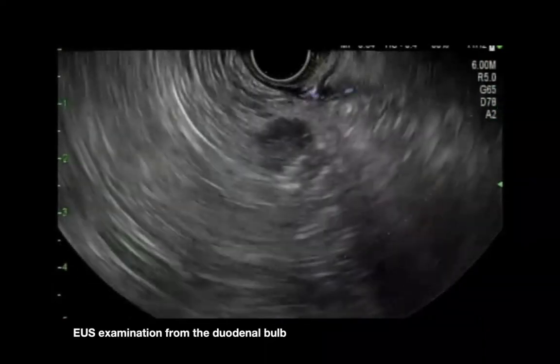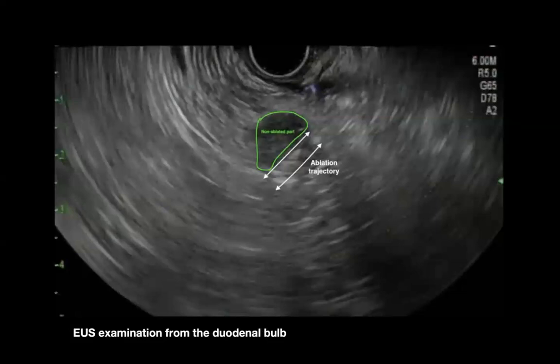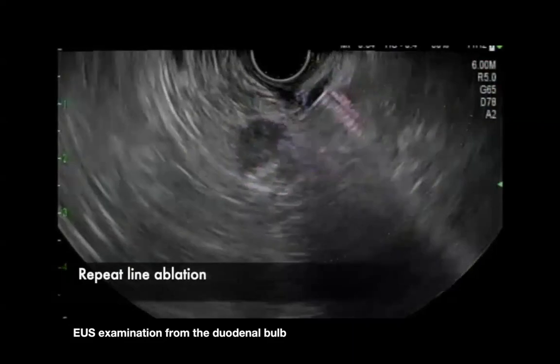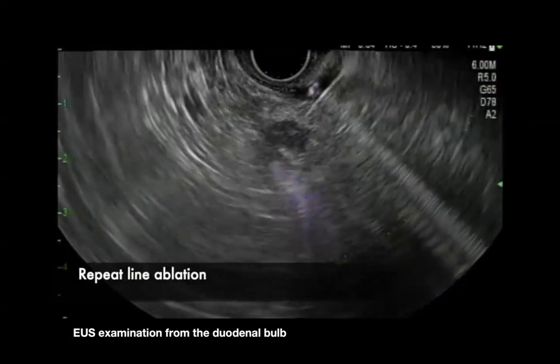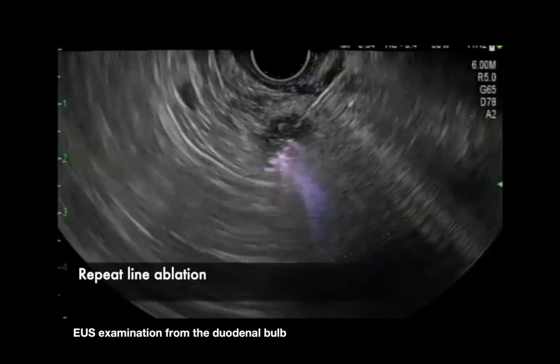Usually, the target of the line ablation is first towards the right lower quadrant of the tumor. As you can see here, the ablation trajectory has burned the right lower quadrant, and then the other parts of the tumor are targeted in a similar fashion, carrying out line ablations. In this particular patient, 4 such linear ablations were carried out in order to completely ablate the tumor.